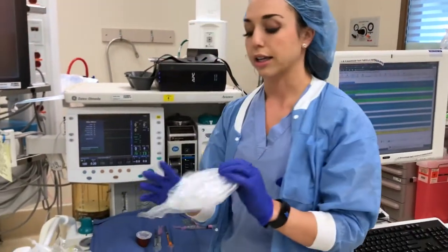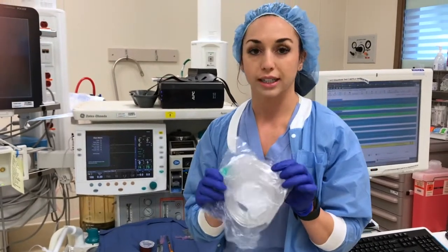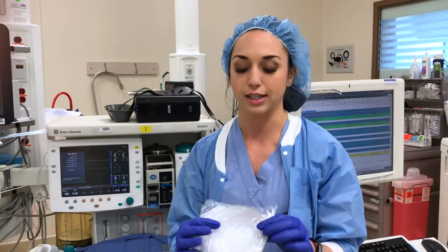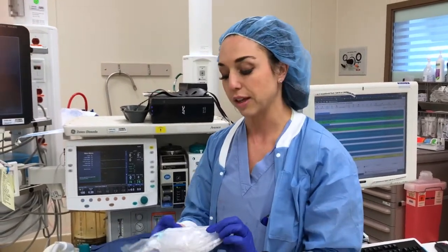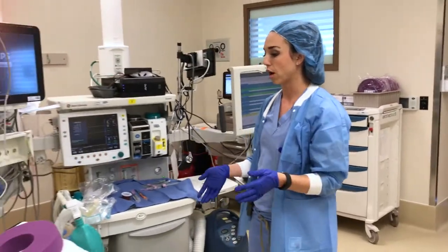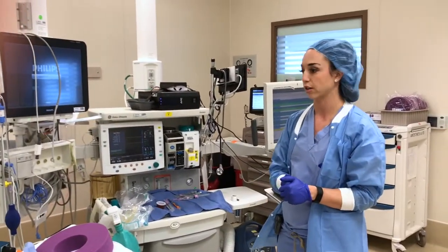And then again, for airway, I like to use a Salter nasal cannula. It allows you to monitor end-tidal CO2 with these patients, especially if you give Versed and fentanyl. But some people like to use face masks, but we'll leave that up to you. So that covers most of MS MAIDS setup for this tubal scenario.